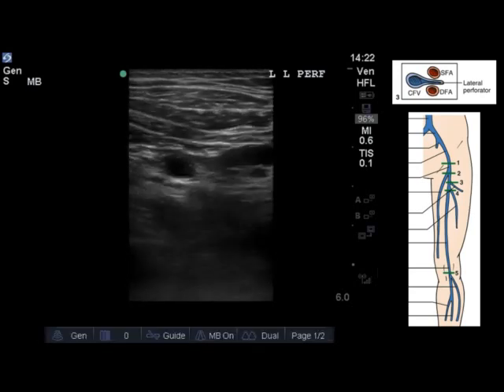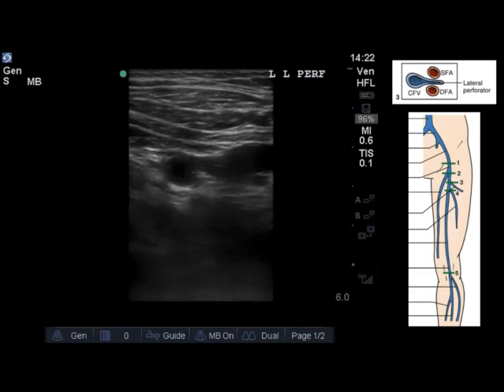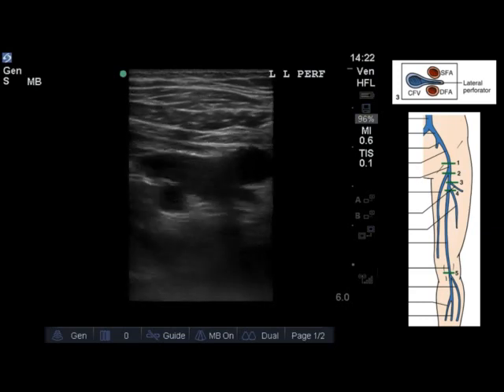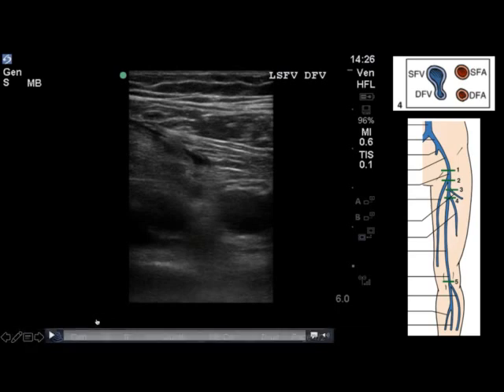It looks like a little teardrop tail moving laterally between those two arteries. This is key point number three of vascular bifurcation that needs to be examined as part of a complete point-of-care ultrasound DVT exam.